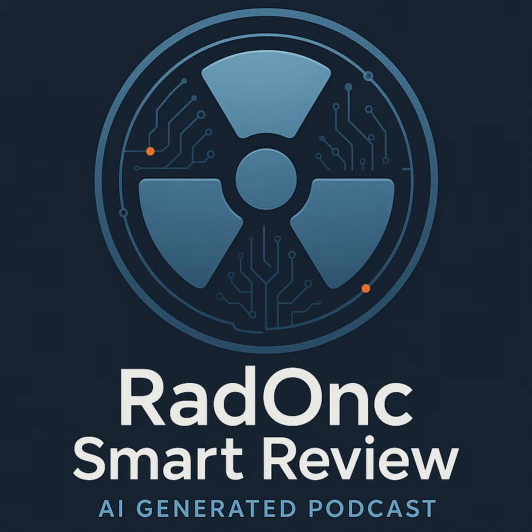And critically, the imagers on our linacs, right? The OBI, the CBCT. Exactly. The onboard imager, OBI, for 2D kV images, and cone beam CT, CBCT, for 3D volumetric imaging right before treatment. Those are all powered by kV X-ray tubes built into the linac gantry. So understanding how kVp and mA work is vital when we look at the CBCT protocols. Why did the therapist use this kVp and mA setting? Precisely. It helps you understand the trade-offs.